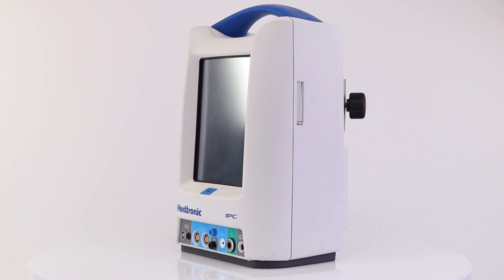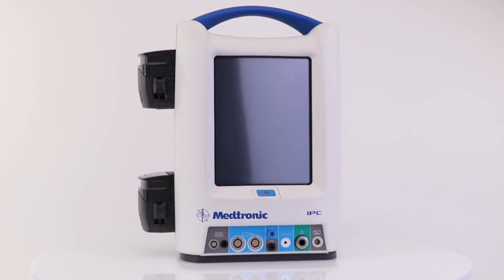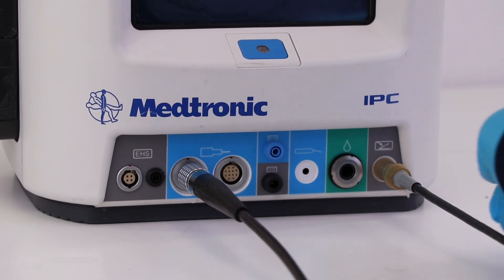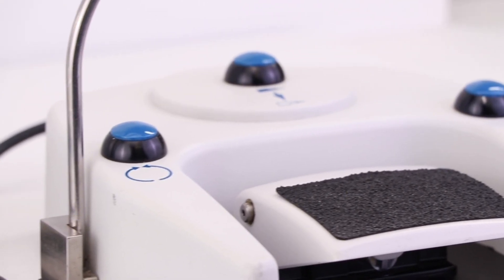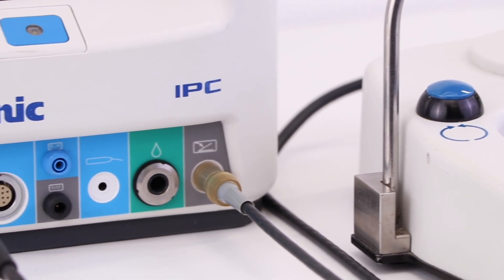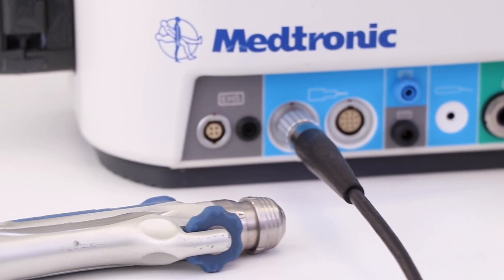The option to connect multiple handpieces at once. The Medtronic IPC system powers all of your favorite Medtronic ENT handpieces, including the Straight Shot M4 microdebrider, the M5 microdebrider, the Indigo otologic drill, the Midas Rex Legend EHS stylus drill, the Endo Scrub 2 lens cleaning sheaths, the Skeeter otologic drill, and the Visao high-speed otologic drill.